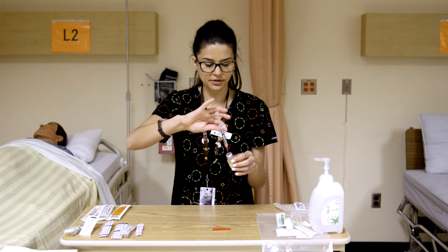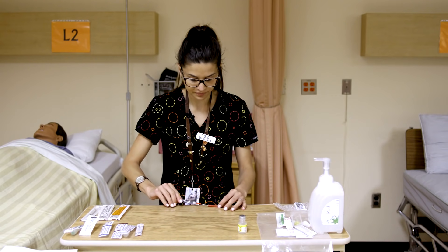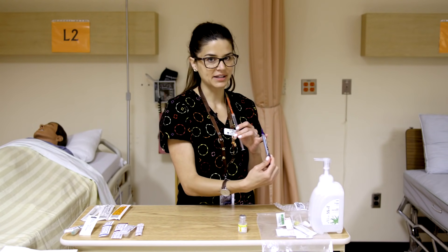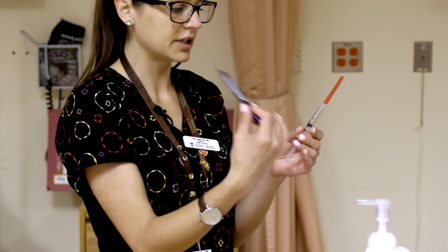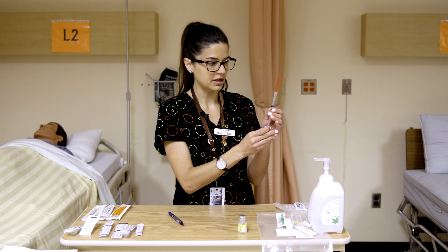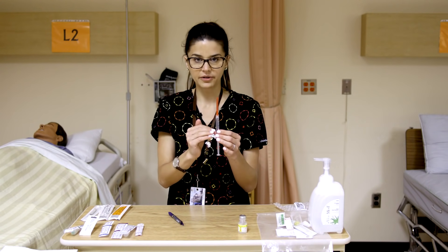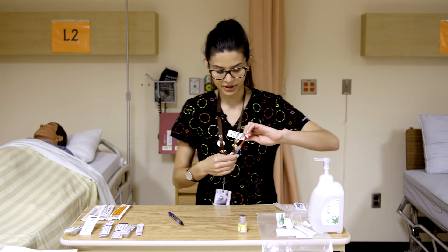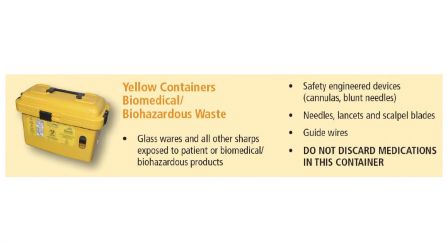We're a little bit past 2ml. Take it out of the vial and recap — anytime you're going to be doing something with a needle you don't want it just out in the open. Pull all the fluid down so it's all within the syringe barrel and not within the needle. Now we're going to remove the blunt fill: it's just that twisting motion, and the blunt fill is going to go into our yellow sharps container.